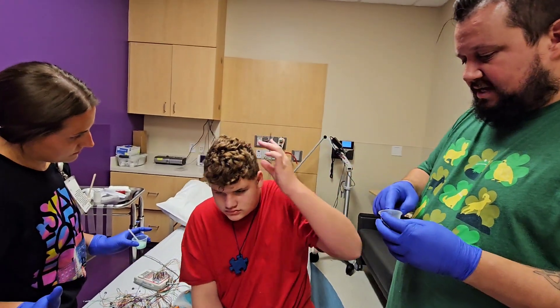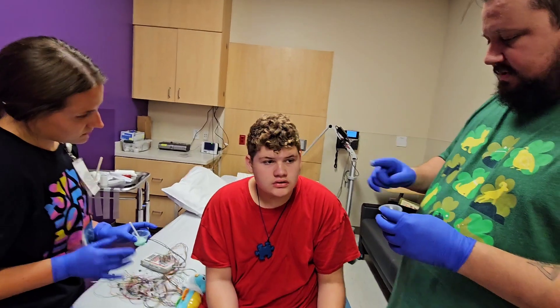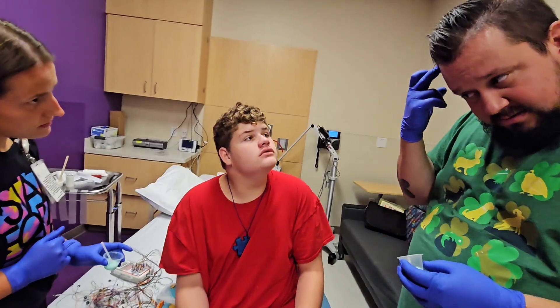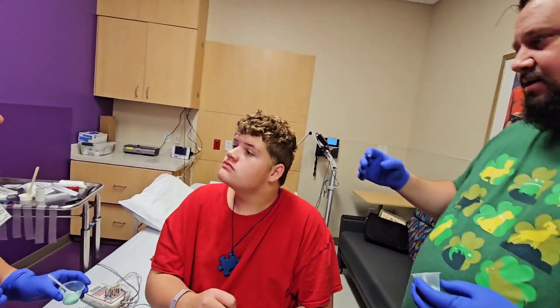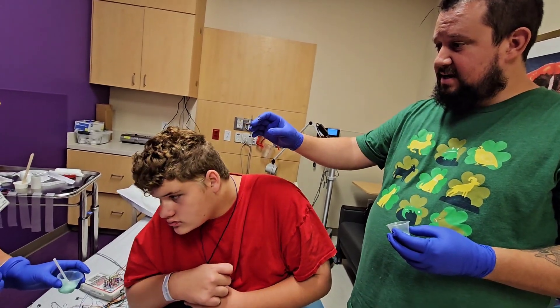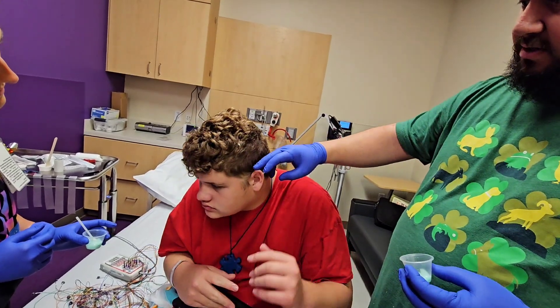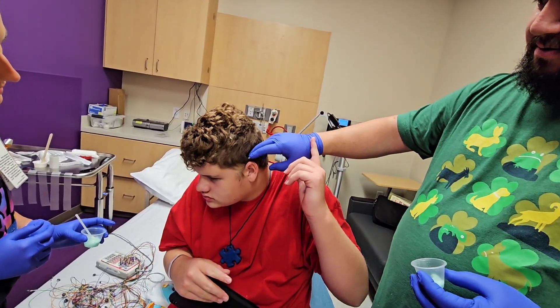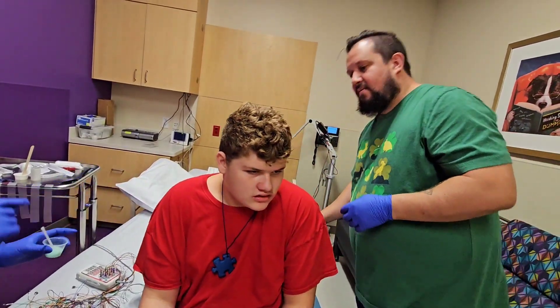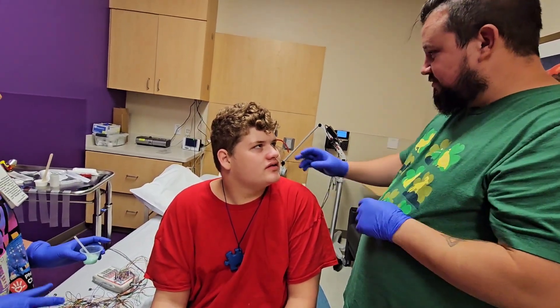That's all, that's it. I put a little bit of soap — do you want a little bit of soap here? You do a little bit of soap, yeah, right there. Good job buddy. Like this — do it. I know it's weird, I know it's weird. You ready? You want to count to three? One, you ready? Hold on — count to three, let me scrub. You ready? It's okay, it's okay. We'll go — I'll touch first, right there. Okay, one, two, three — gotta count while I scrub.